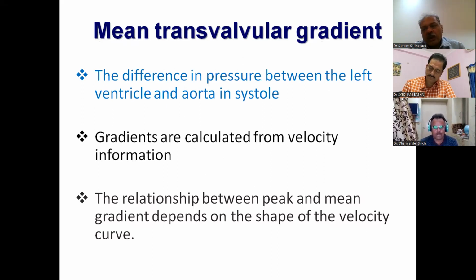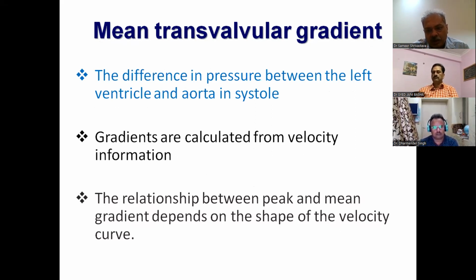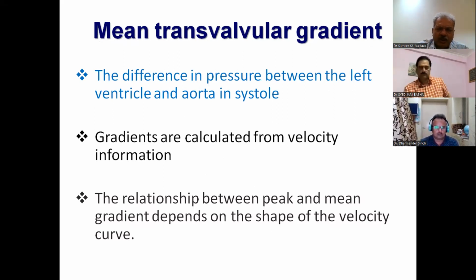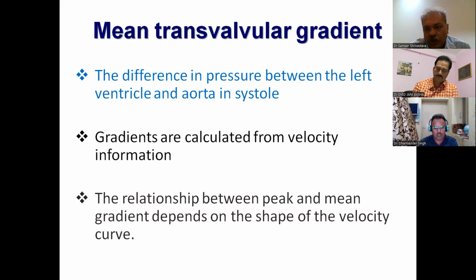Now, the world has moved on, and fortunately across the Atlantic also they have come to some kind of unison on what should be the criterion to label aortic valve stenotic. So instead of peak velocities, which have their own relevance, I'm not saying that they have lost their relevance completely, it is the mean gradients, which is the pressure difference between left ventricle and aorta in systole. The mean gradients are calculated. So you don't have to work too hard to do it. All you have to do is trace it, and all commercially available machines have this inbuilt algorithm to calculate mean gradients.